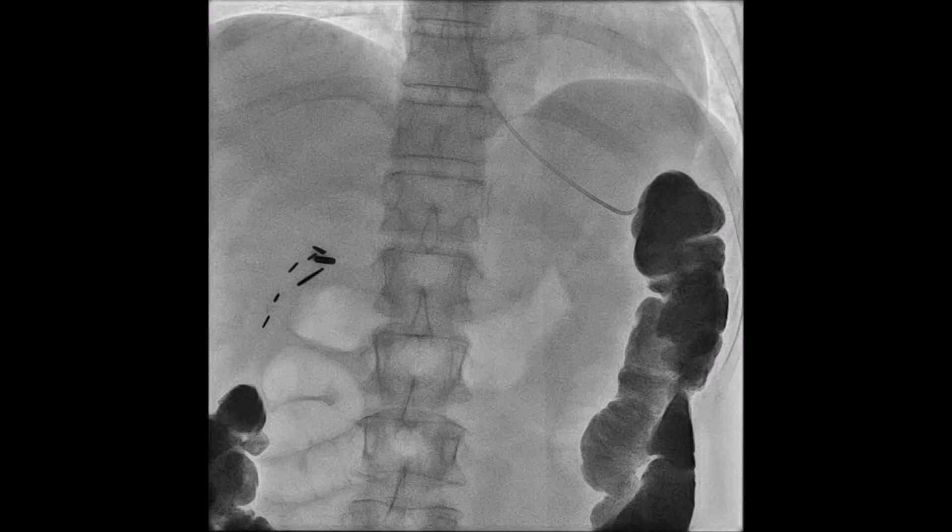This is my scout AP view of the abdomen before we've really gotten started. A couple things to notice: first, contrast outlines the colon — I'll have my patients drink barium the day before the procedure, and I like having the colon opacified with contrast. Some IRs will say it's not critical, but for me it certainly makes things easier. Second, there's an NG-tube coming in from the top of the screen. Either myself or my nurse will place a 5 French angle-tapered glide cath into the stomach before we get started. This will allow us to distend the stomach with air before placing our T-fasteners.